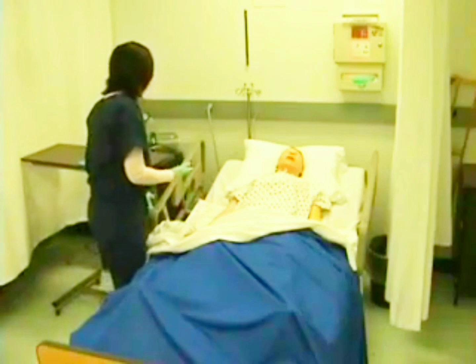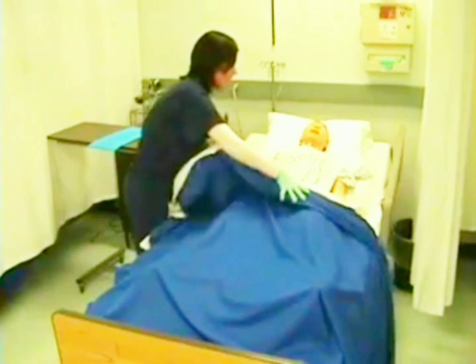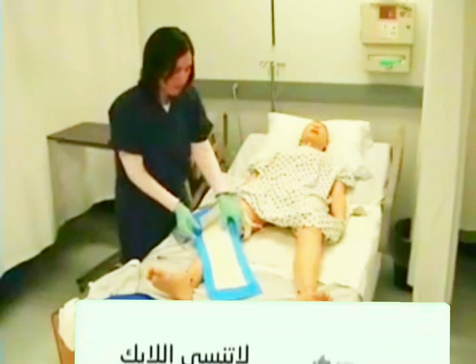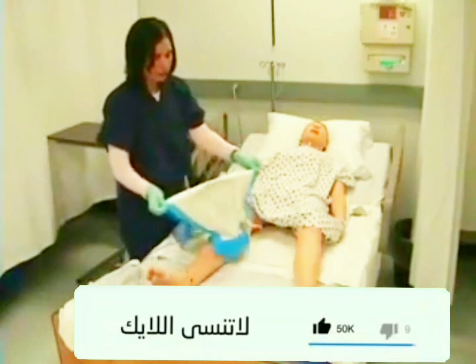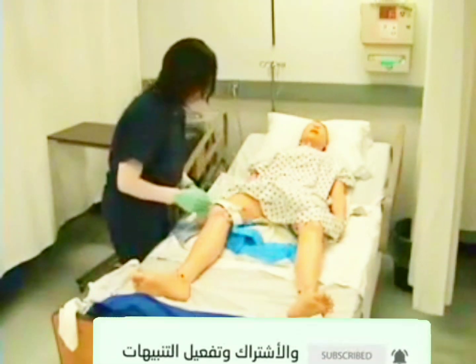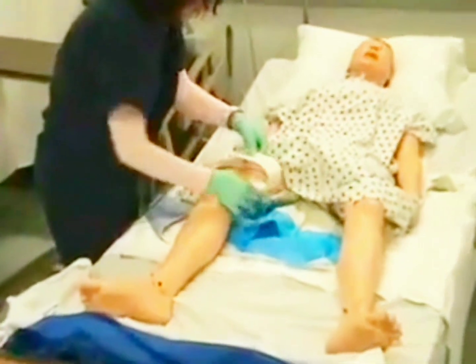And I will document this in my nurse's notes. I'm going to put the bed up and pull the covers down a little bit. I'm going to place a blue absorbent pad under my patient just to catch any drips of urine. I'm going to remove my Velcro leg strap and dispose of it in the trash.